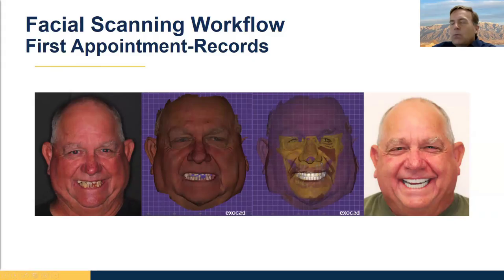But man, as a technician, once you get spoiled by this, it's hard to go backwards. And for you guys, it gives you the opportunity to do a virtual try-in. Now, probably most of you, the first time you do it, you'll be like, I don't know. But it doesn't take too long. The virtual try-in and the real try-in are exactly the same. You're like, I don't want to do any more analog printed try-ins.